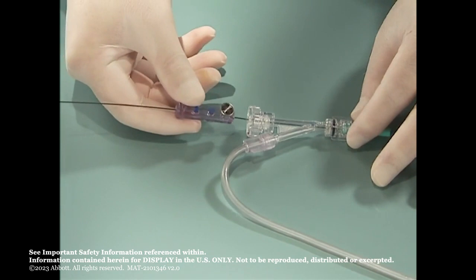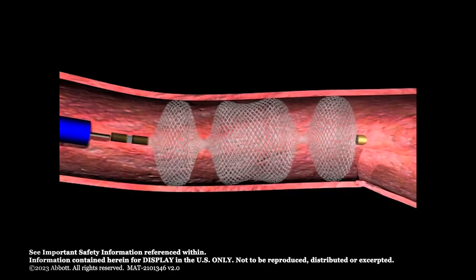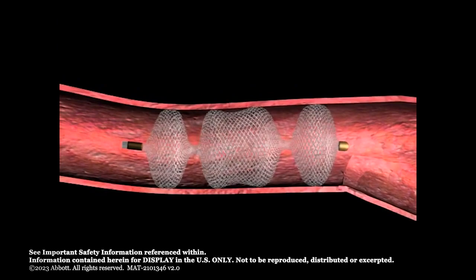Once the Amplatzer Vascular Plug 2 position is satisfactory, attach the plastic vise to the delivery wire. Stabilize the sheath or guide catheter and rotate the delivery wire counterclockwise until the wire separates from the plug. Remove the delivery wire and delivery system from the patient.